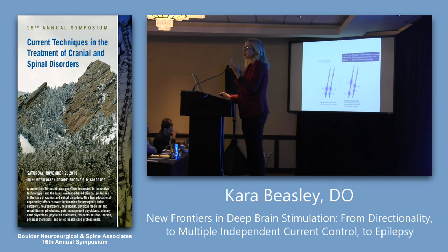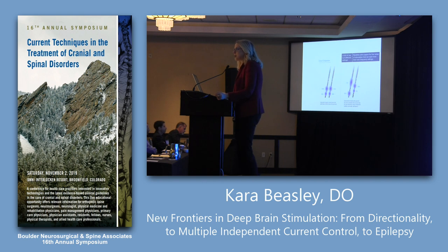when I go to my meetings and sit down with a lot of the researchers and investigators, like Francisco Ponce down in Phoenix, we talk about how certain folks have both essential tremor and Parkinson's. You have to pass through the essential tremor target in the thalamus to get to the STN target in Parkinson's. An 8 contact lead actually spans that difference. And not only that, this 8 contact lead will allow, with one generator, 4 different areas of specific control.